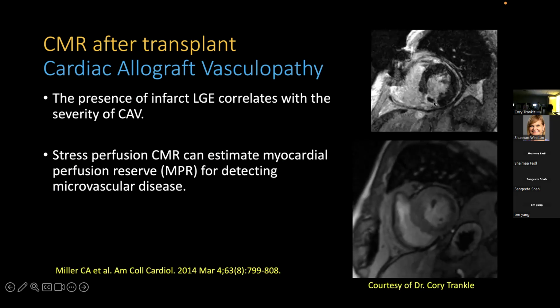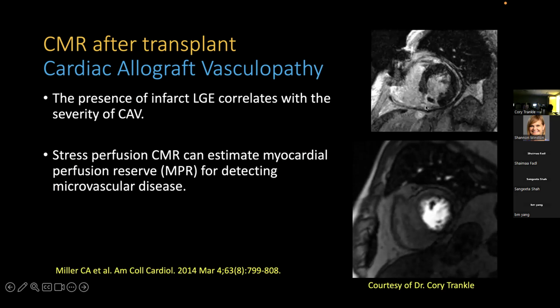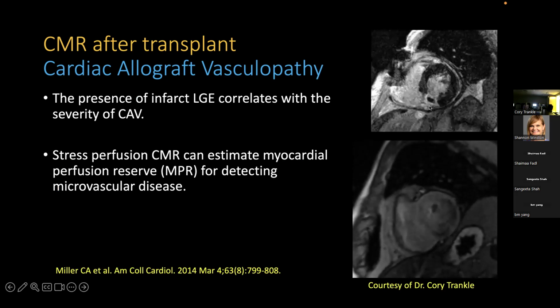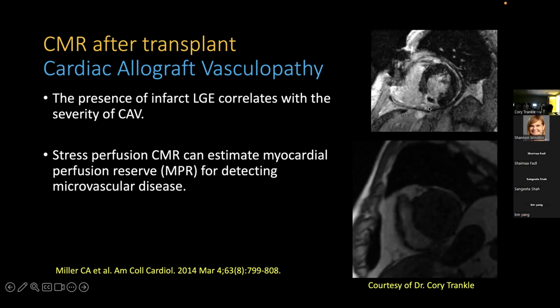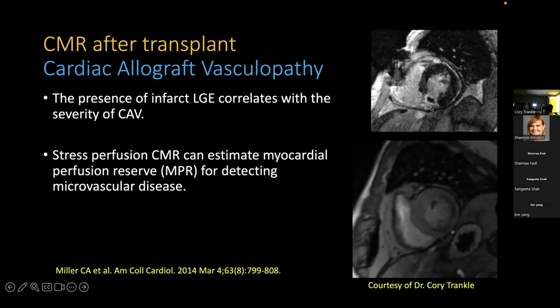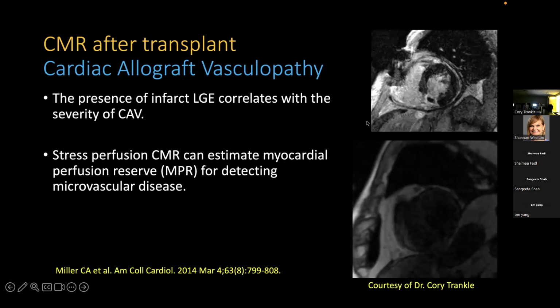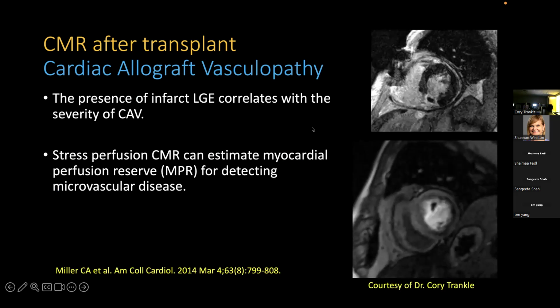The presence of LGE correlates with the severity of the vasculopathy. So that goes back to the fact that the more LGE, the worse the prognosis. And one of the things is that it correlates with severe allograft vasculopathy.